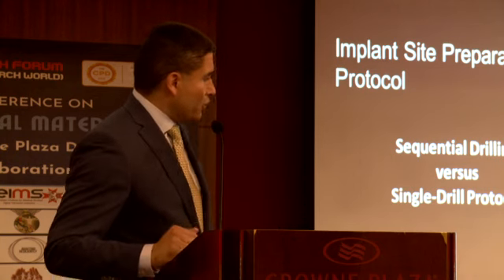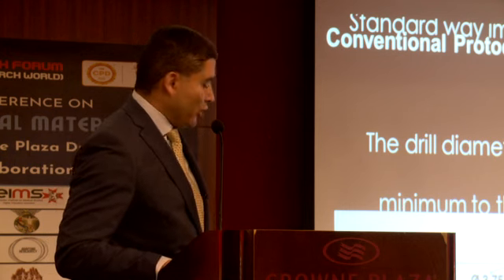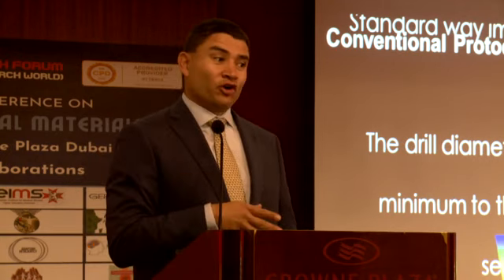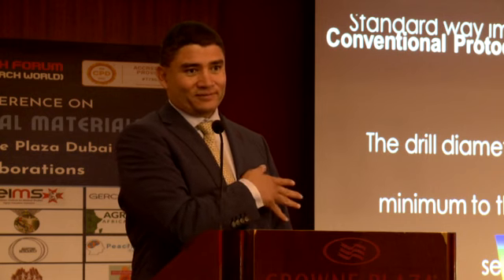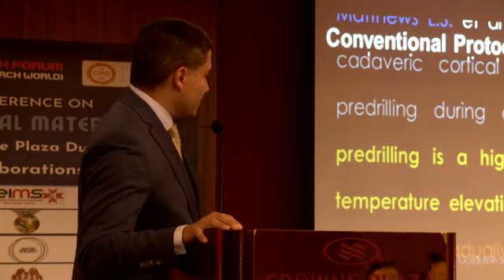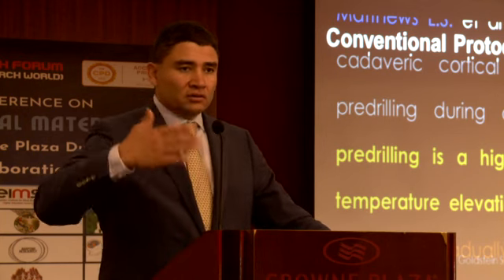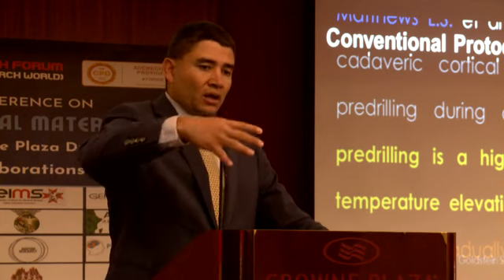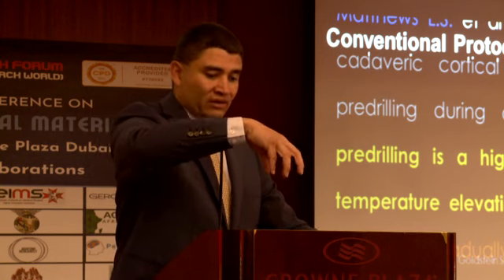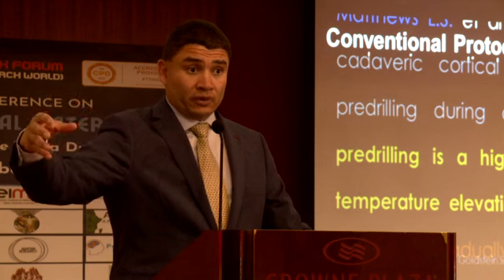Well, research has shown that multi-drilling will help you clean up the damage that you have done from a previous drill sequence. So we believe, right? In the protocols that exist, the literature has shown that the more drills you use, the drill before creates some damage, the following drill cleans up the damage, and that's a fresh wound. So the next drill cleans up, the next drill cleans up, and so on and so forth, right?